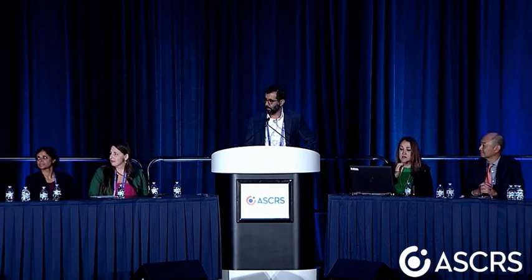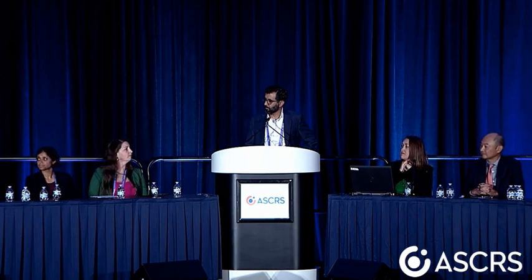Great talk, Sam. The only thing that I do differently is I use a 30 gauge needle to add the air. I just do that because I also do it at the slit lamp, and the patient tends to move, gets a little antsy, and it's harder to keep that cannula perfectly planar within the wound. I've lost chambers before. If you have a 30 gauge needle, the patient can do all they want, and you're going to keep the chamber stable.